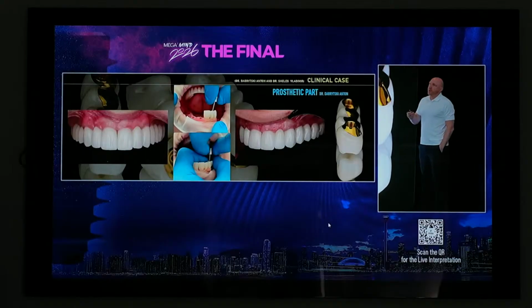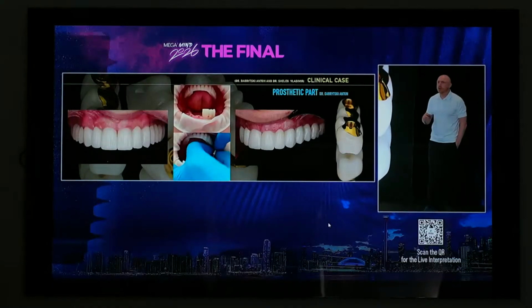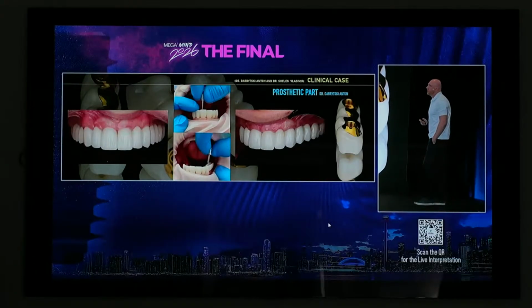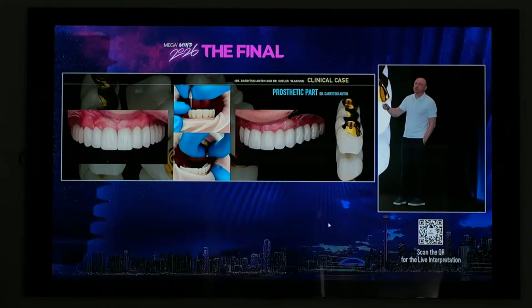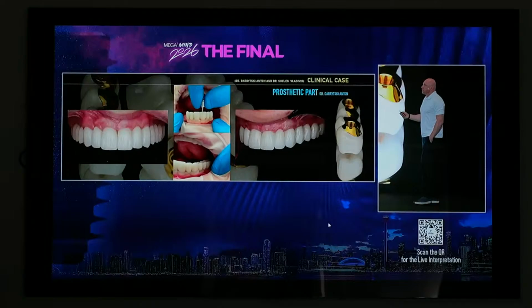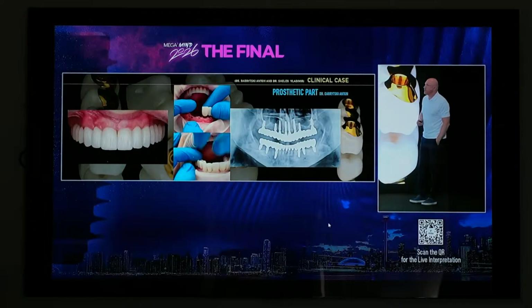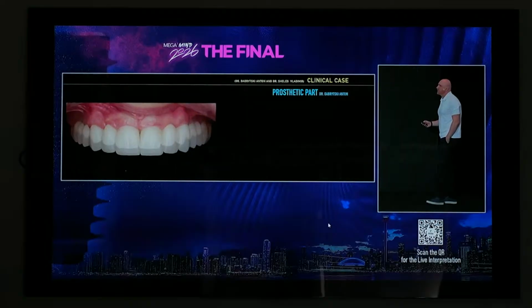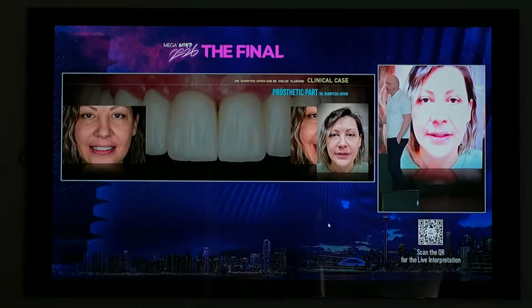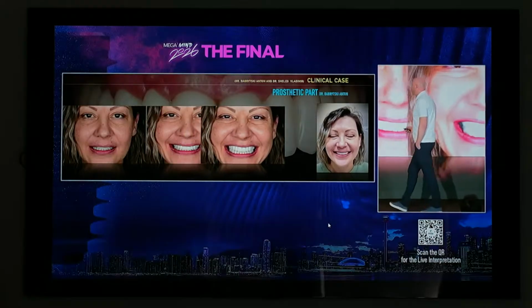So I took away the temporary bridges, put in zirconium bridges with titanium bars, and fixed them with regular Megagen screws. Then a control panoramic X-ray. It's rather beautiful. And this is the final result that we can receive with such a construction, I mean titanium bars with zirconium bridges.